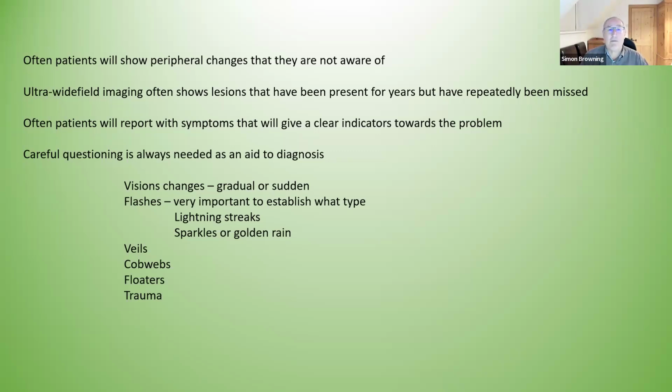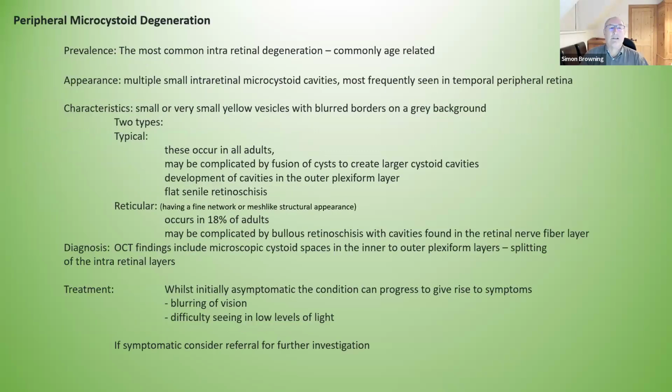Interestingly enough, in a recent paper that's just come out from an ophthalmologist, one of the most common causes of eye injury nowadays is paddle. So this great new popular sport is actually causing the ophthalmologists quite a bit of problem at the moment. But all of these factors will help you build your diagnosis and your understanding of these. So let's look at some and see what we're looking at and what they actually tell us.